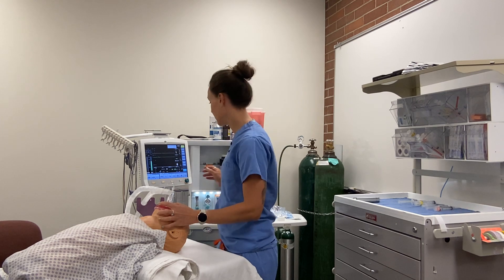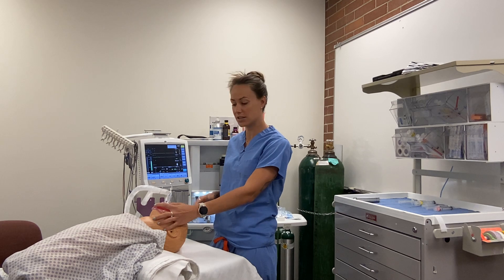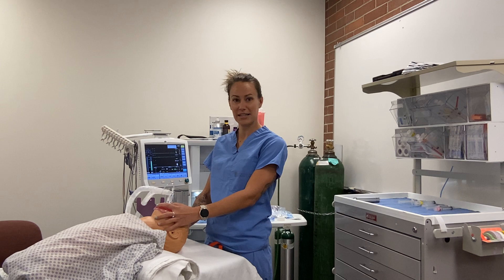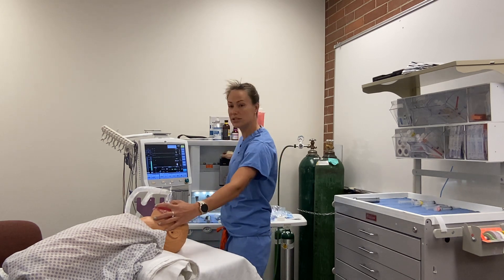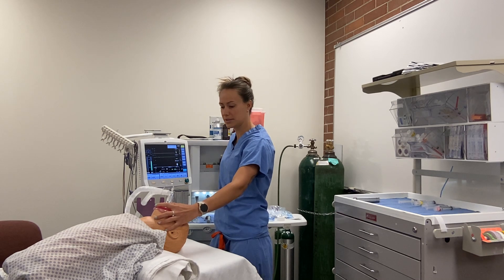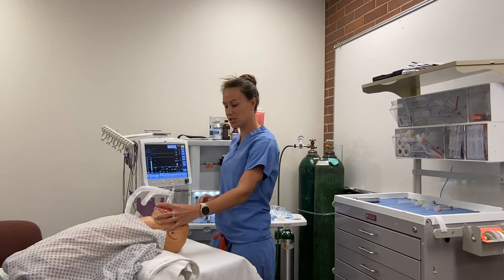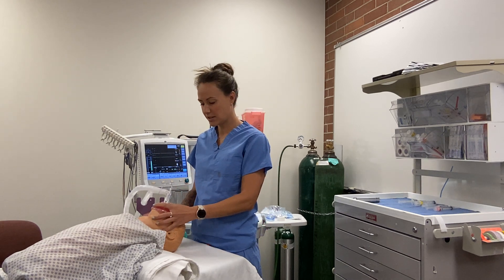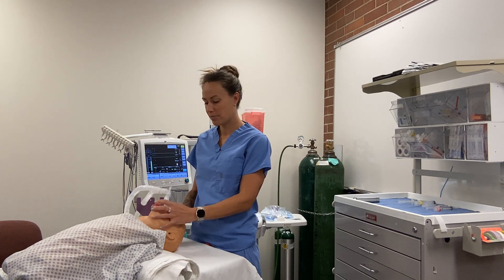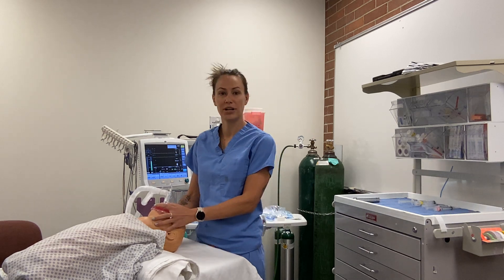Our settings for nitrous and oxygen: nitrous is going to be at 7 liters, oxygen at 3 liters. Because this patient is cooperative, we're going to slowly turn up our sevoflurane 2 to 4 to 6, up to 8 if needed, until the patient is asleep. If the patient is uncooperative, we still have nitrous at 7 and oxygen at 3, but we crank the sevoflurane straight to 8 and hold on.